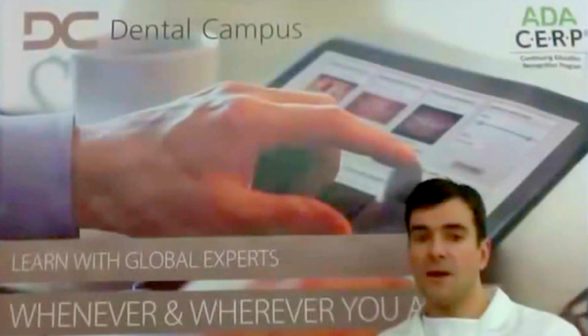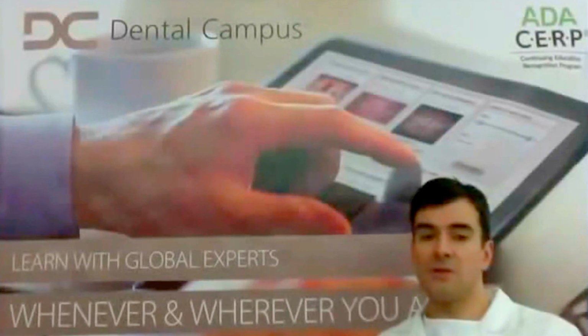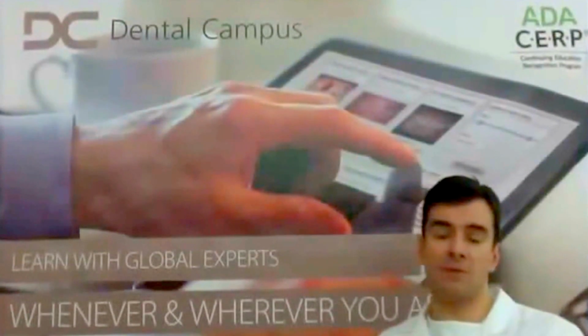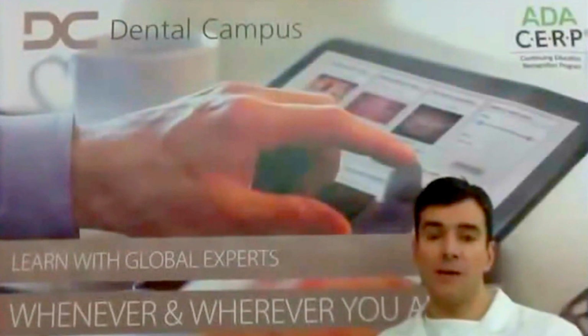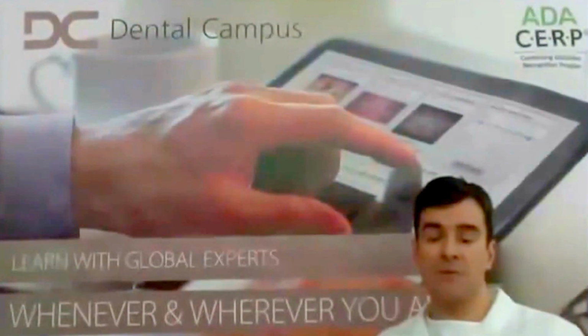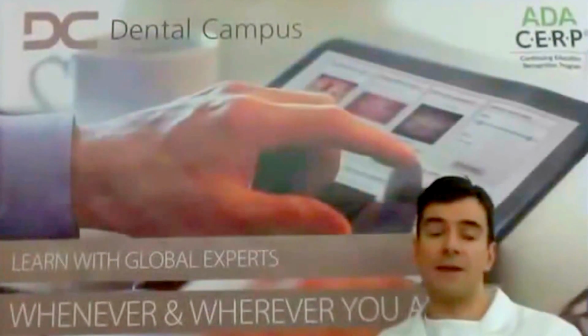So for me, less than 8 millimeter is a short implant. I consider an 8 millimeter long implant a regular implant. Below it is a short implant. With, for example, a 6 millimeter long implant, no, I don't modify my procedure, and I decide my procedure.